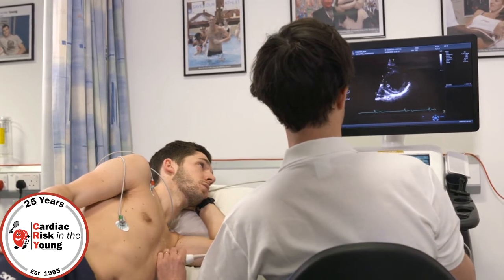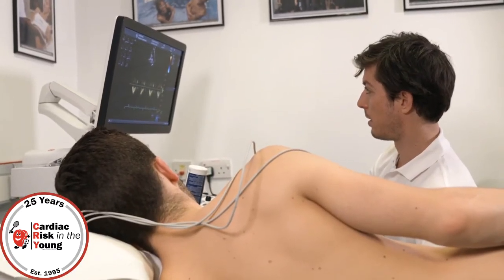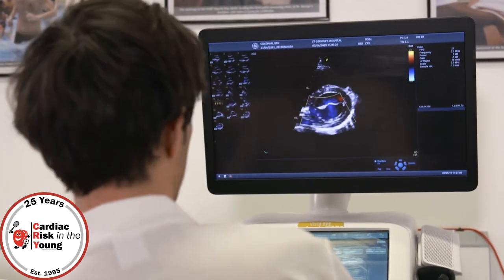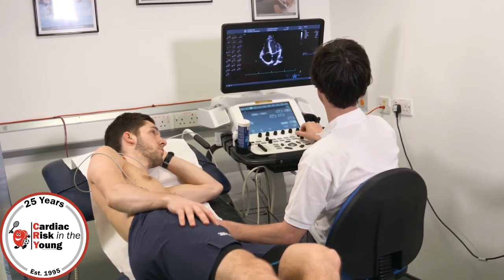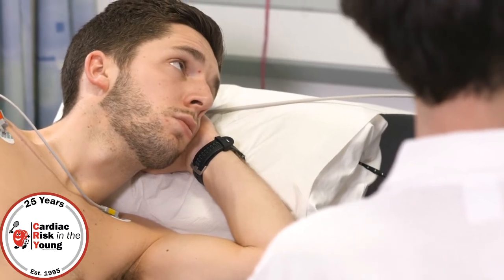And in a moment you'll be able to actually hear your heart beating. We're making sure when we look at the structure of your heart that everything's the right size, and that everything is working well, and we're looking for any typical abnormalities. We're listening to the way your left ventricle, your pumping chamber, fills.